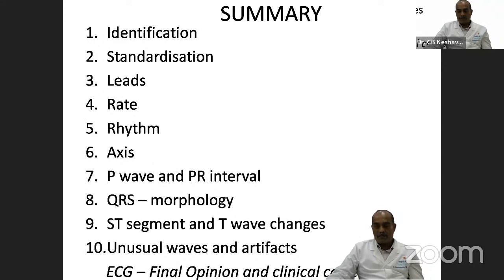You may be told to interpret an ECG which you get on the phone or you get on the mail. Then you have to go perfectly according to these points, and wherever possible, try to get a history and then give a proper diagnosis. Only relying on an electrical signal without looking at the patient, without looking at the physiology, without looking at what mechanical problem the patient has may lead to misdiagnosis or wrong diagnosis, which may finally lead to a wrong treatment.